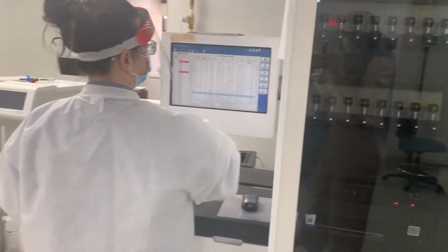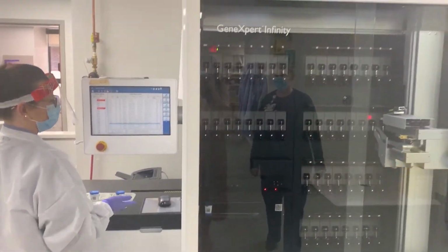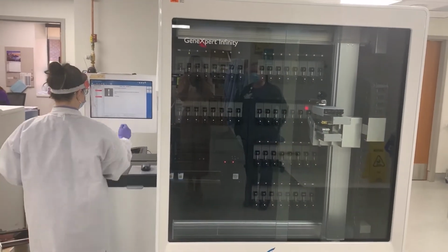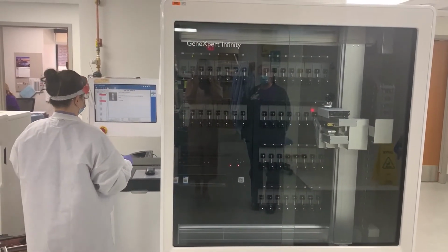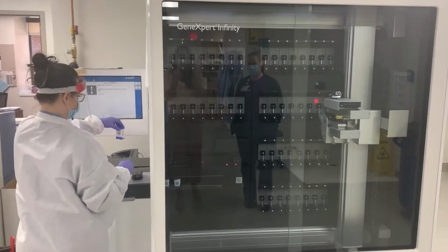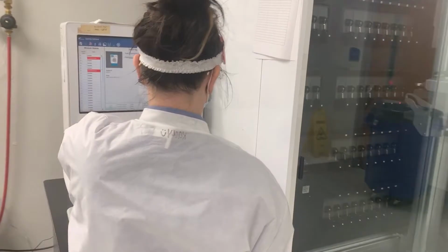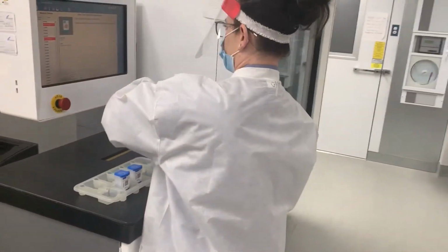This is our Cepheid GeneXpert Infinity. It's our PCR instrument. PCR stands for polymerase chain reaction, and what it does is it takes the target and it multiplies the DNA, and then it uses certain thresholds to tell you if it's a negative or a positive.